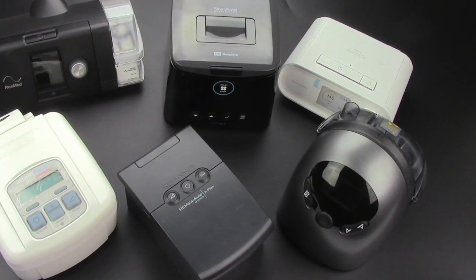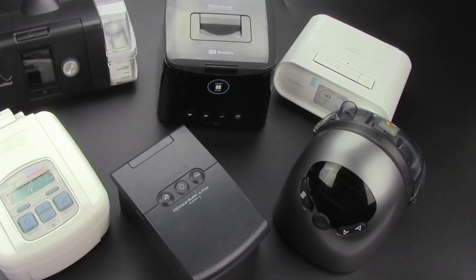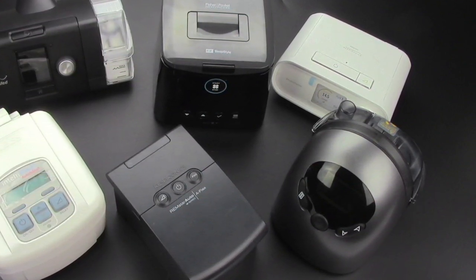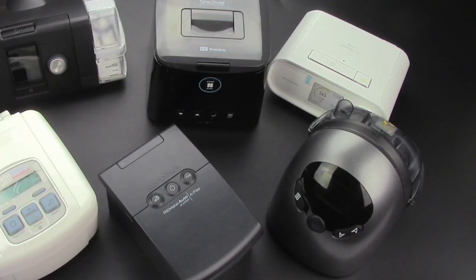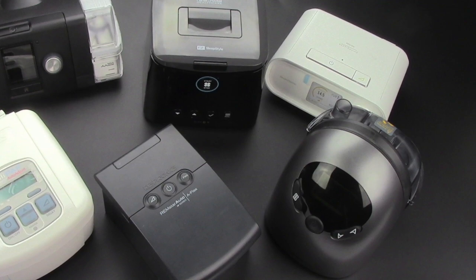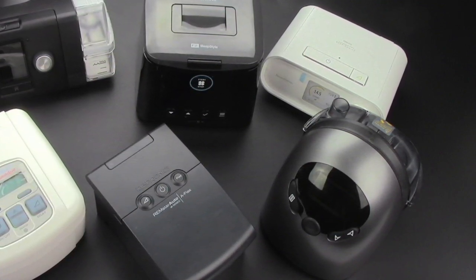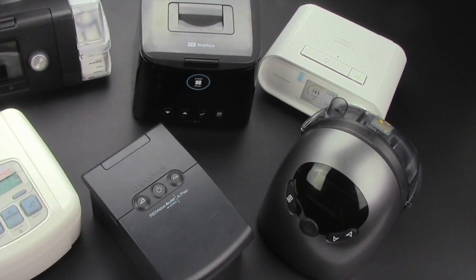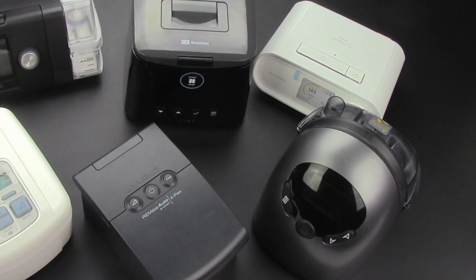Sometimes you can use a male to female DC connector from that battery and from the CPAP machine to help with that. Sometimes it'll run then. That's why I always recommend that you use their dedicated battery, just for troubleshooting options. If you do go with a third party, those are just a couple of things you need to consider.